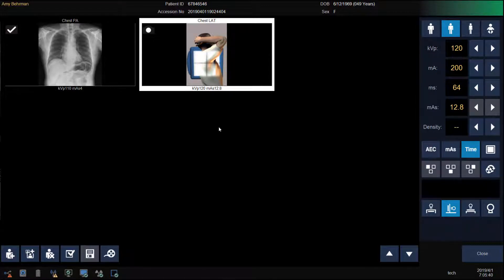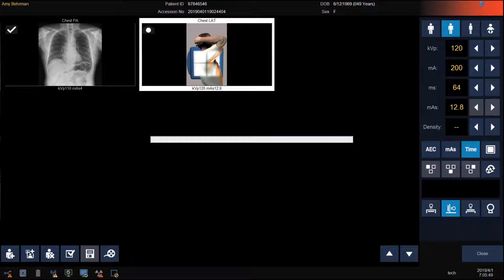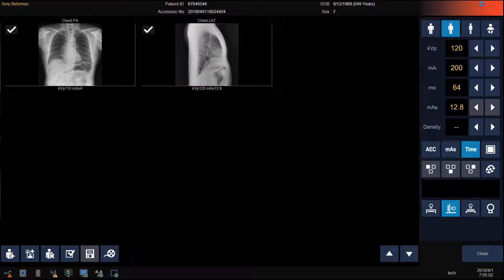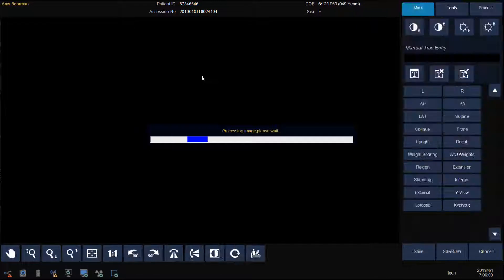If you need to add a marker or crop your image, double-click to open it. If not, go on to the next view. Repeat the steps. Click Close to send the study to PACS, or double-click on the image to make a change.